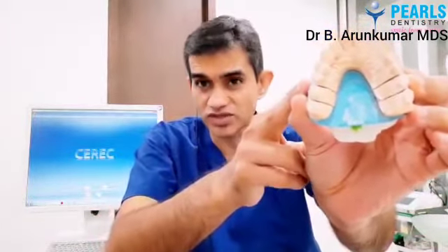So in an impression, what happens? Once we have the negative, then we pour a model either in plaster of Paris or a stone to have your teeth model like this formed. So the negative is used to form the positive model. In CEREC, we completely eliminate the step of a negative and then forming a positive model. We directly scan the tooth, which forms a real-time 3D reconstruction of our tooth.